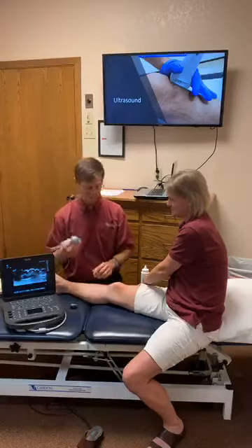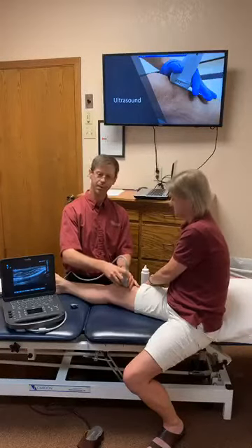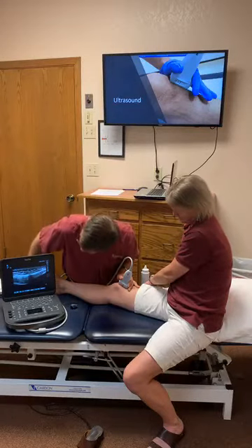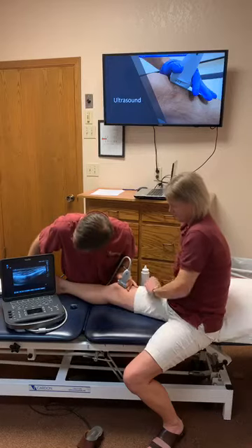Perfect. Alright, so we're going to look at her quad tendon here. Not used to looking at it upside down. Want to come in front?